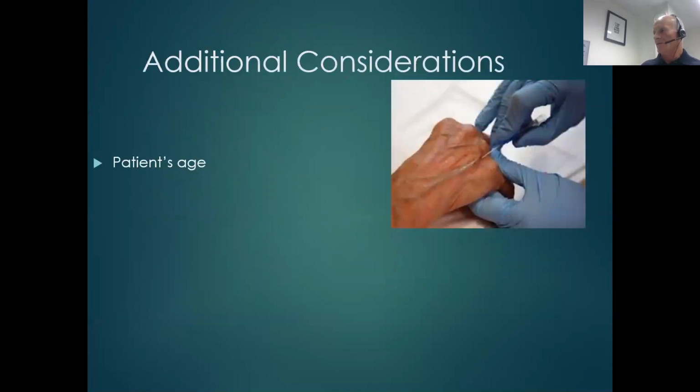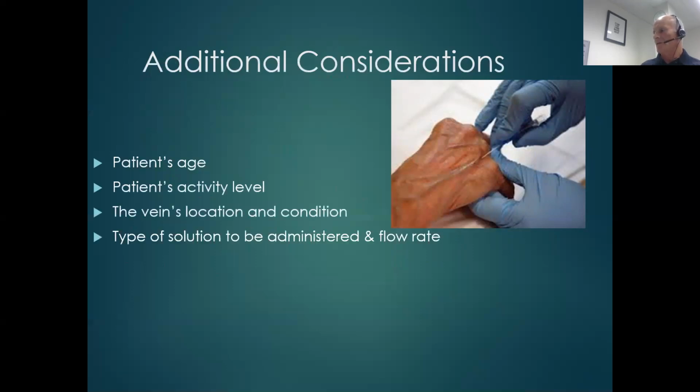Additional considerations: patient's age, patient's activity level, veins location and condition, type of solutions to be administered, and flow rates. Very much an in-hospital understanding there.